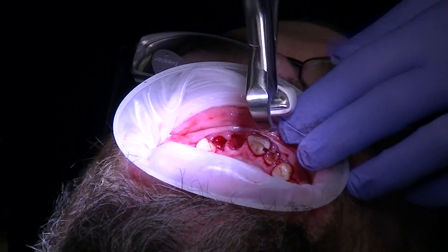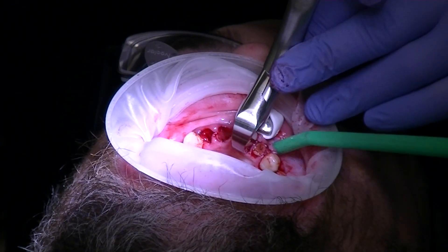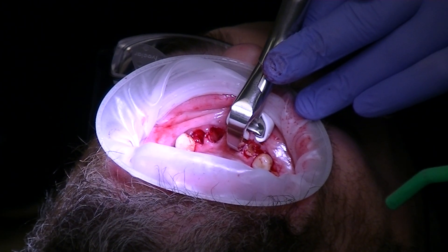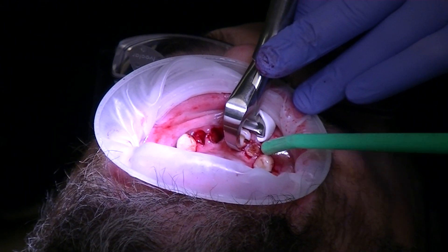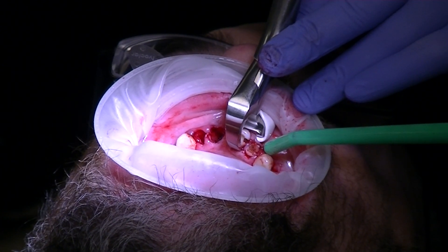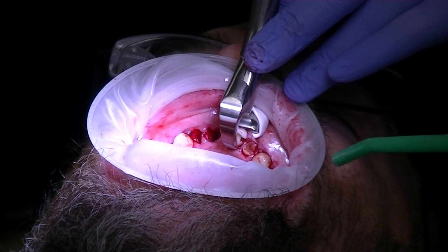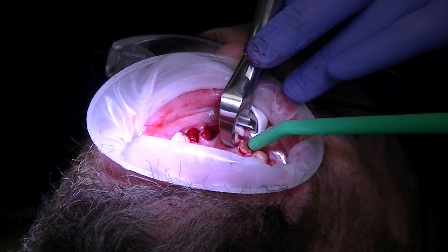Keep moving around to this side. Make sure I'm parallel to the long axis of the tooth and put a little pressure. Reposition to stay parallel to the tooth, keeping it at that 10 to 15 degree angle. Let the pressure build up — we want constant pressure, not pumping. Just take it another five degrees and I can feel it give.